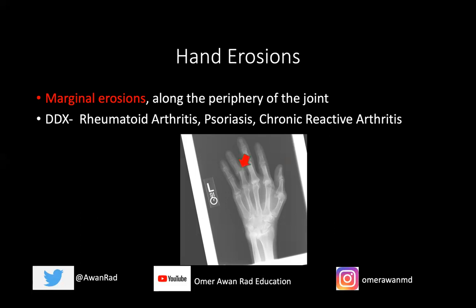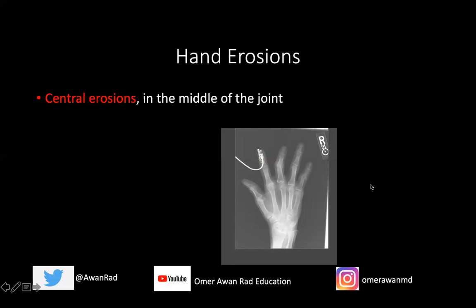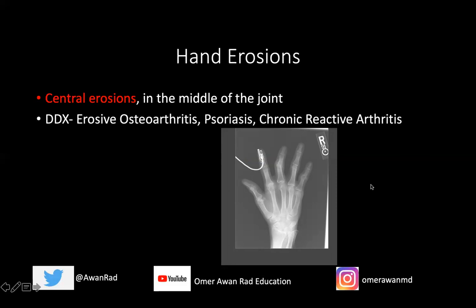The last type of erosion is a central erosion. For example, here at the fifth PIP joint, you have loss of bone in the center — the middle — of the joint. The differential for this would be erosive OA, psoriasis, and chronic reactive arthritis. Erosive OA is the prototypical type, giving the seagull appearance where you have osteophytes along the edges and a central area of lucency or loss of bone. But psoriasis and chronic reactive arthritis can also have central erosions.